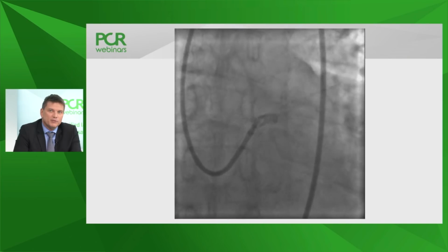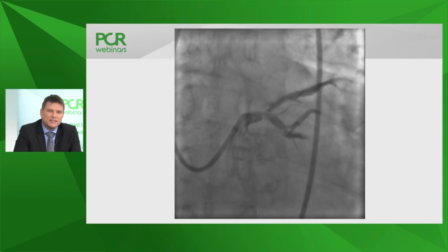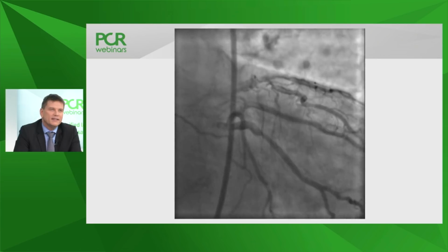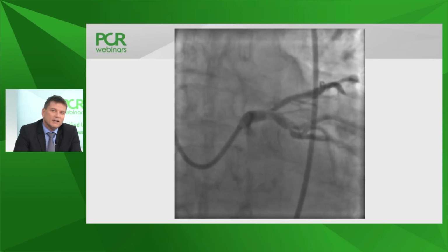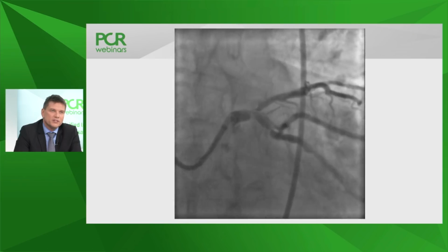Chris, do you think the balloon will cross in this tight lesion here? Actually, I think so, but the question is whether a balloon is enough for these patients. Because if I look at the angio, this looks like very eccentric, heavily calcified, bulky calcified disease. So I think the balloon will cross, but I think there are good reasons for rotablation here.